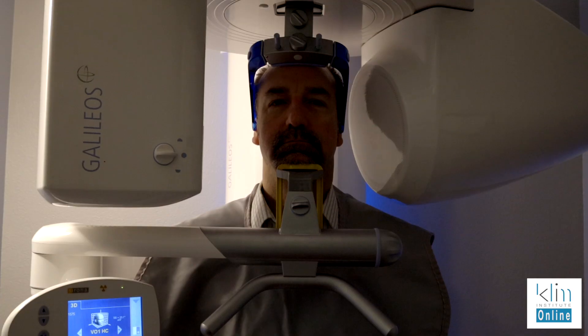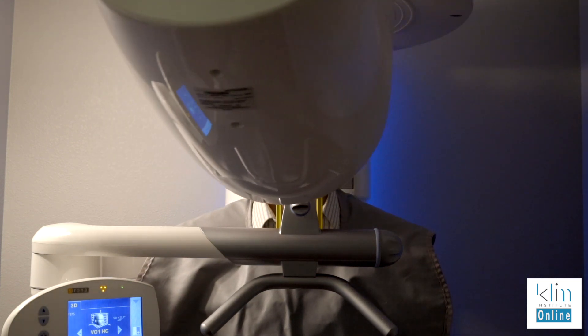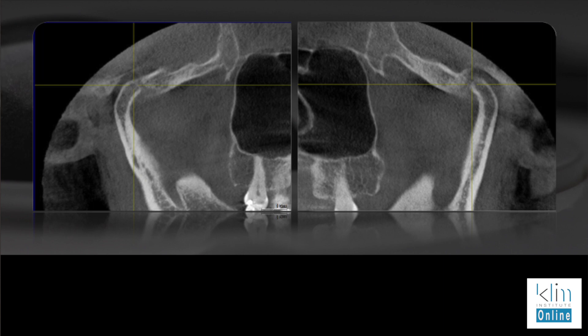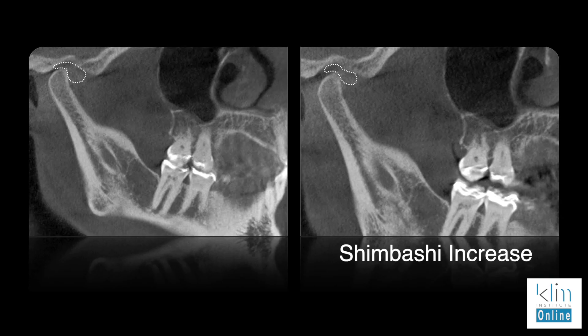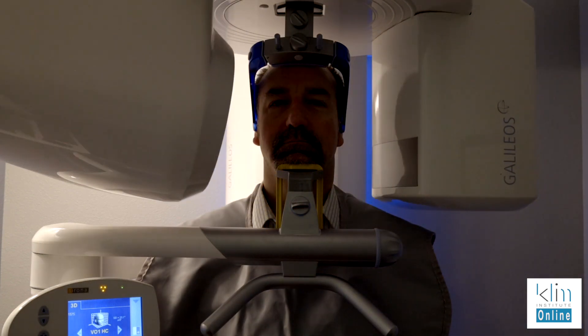I don't want compressed jaw joints, and that's where I find the CBCT so helpful. I take that on every adult patient I'm treating — it's my normal exam protocol. It really helps me understand the functionality of the patient. If they have condyles that are really beaked, I know that happened in their developmental phase. If condyles are more compressed up and back, I know they have an occlusal overclosure issue. By looking at jaw morphology at the lateral pole, we can assess the angle of the condyle to the maxillary cranial bone. I've been using joint-focused X-rays for well over 20 years.